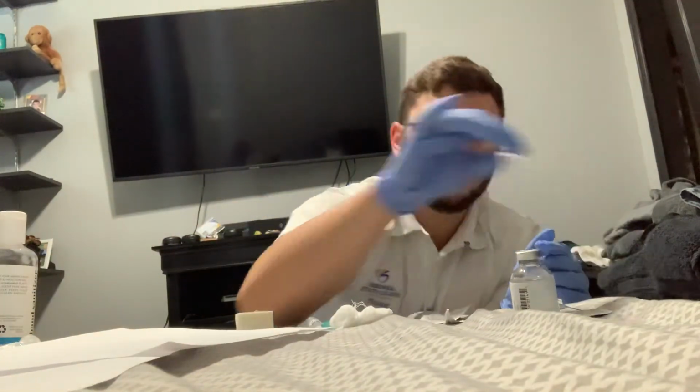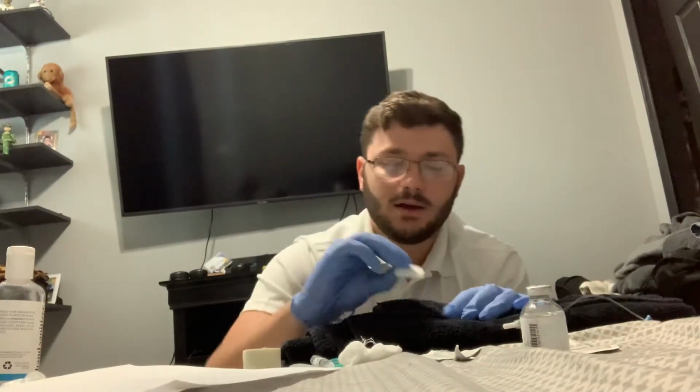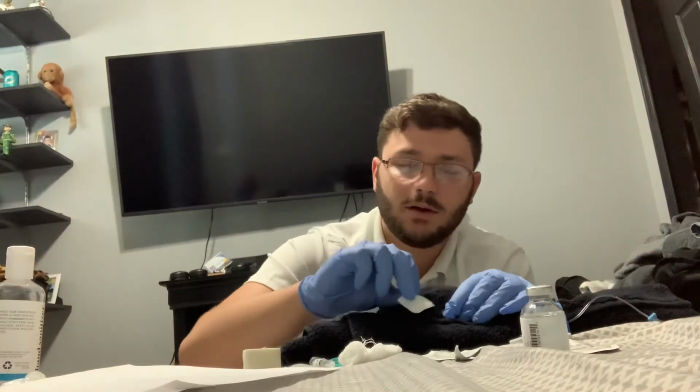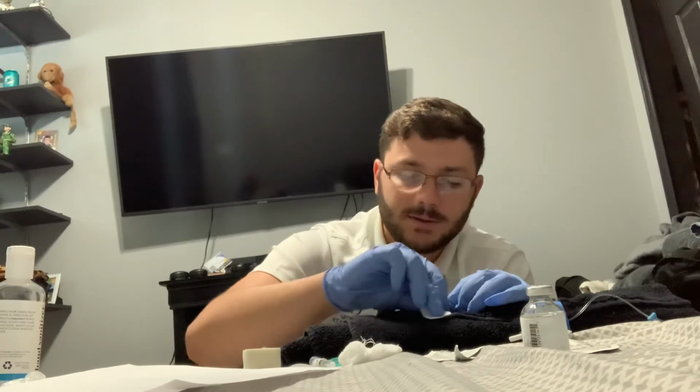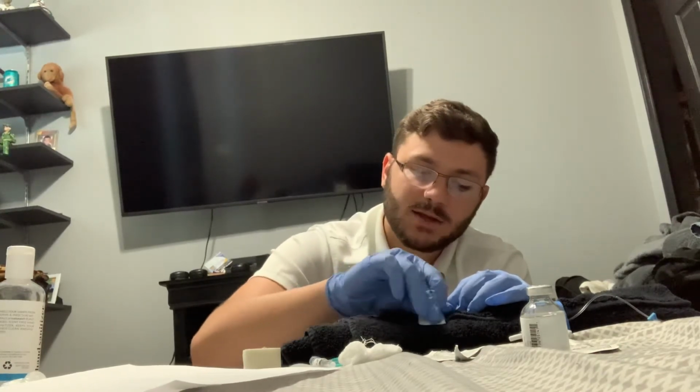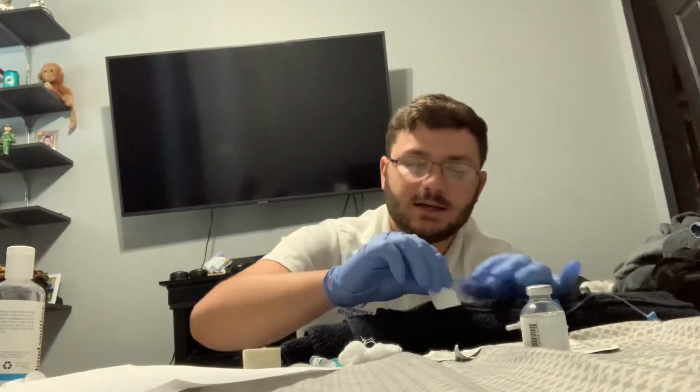So now, if this is the deltoid, I'm going to be starting right here at the end, and then using almost like a triangle method. We're free anywhere in this area, okay? So if this was the arm, I'm going to be sanitizing with a brand new alcohol pad, in circular motions from least contaminated to most contaminated, outward in a circular motion for 30 seconds. So that is 30 seconds. Now I'm going to leave the alcohol pad pointing to the area which is ready to be administered.